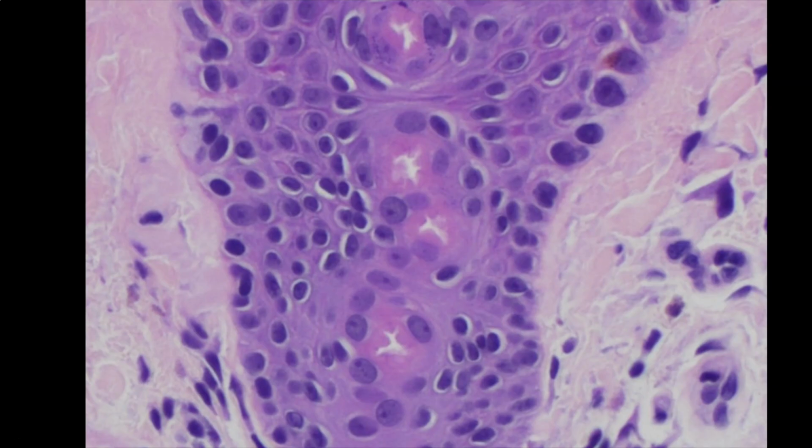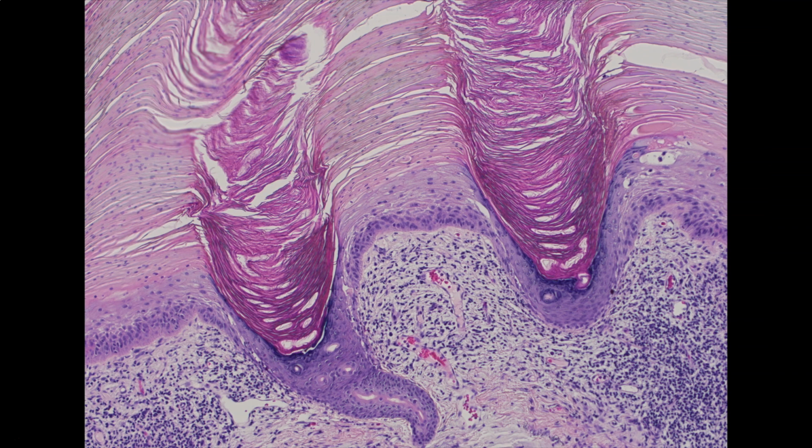Here's a closer look at that. So that is the eccrine duct emptying out to the skin surface. And this is not normal skin here. This is an actinic keratosis, which is a precancerous lesion that arises in people who've had years and years of chronic sun damage. And some of these go on to develop into squamous cell carcinoma.